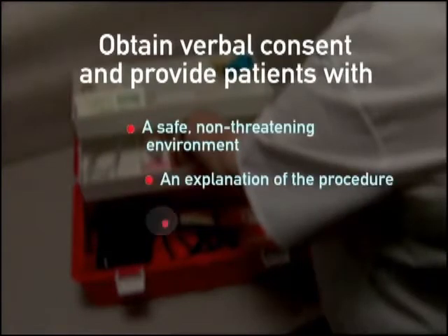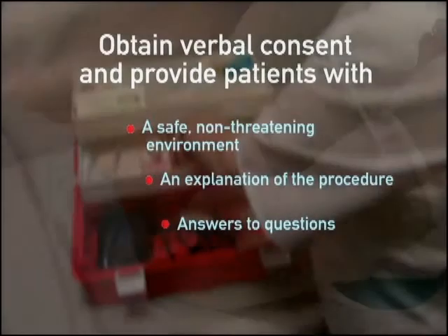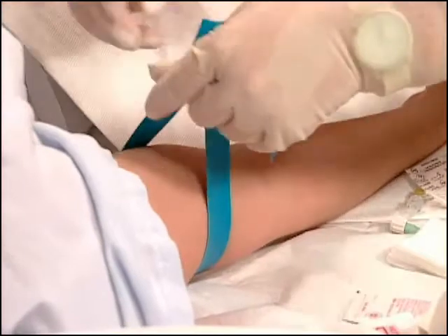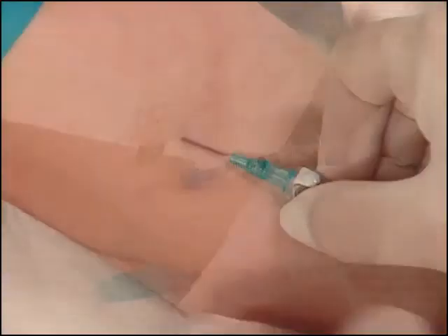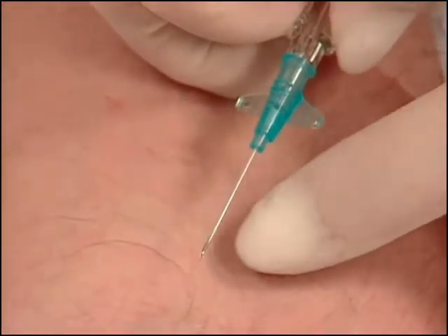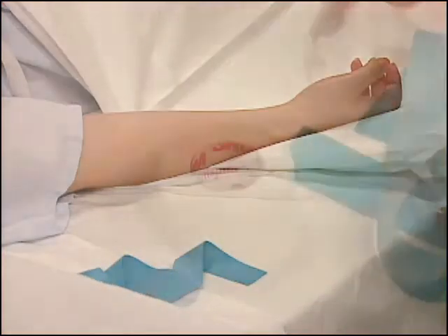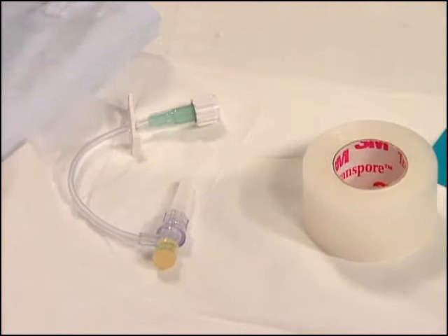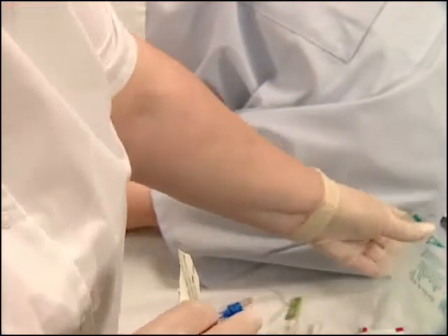These goals can best be attained by explaining to your patients the reasons for the procedure and describing the steps needed to accomplish the task. In order to gain the confidence and cooperation of your patients, begin by making them as comfortable as possible, and then inform them about the procedure at hand. Address patients using language that would be understandable given their age and background. In some cases, this may require an interpreter.